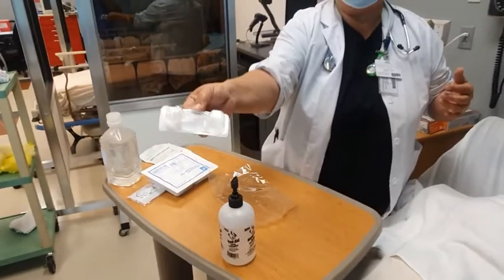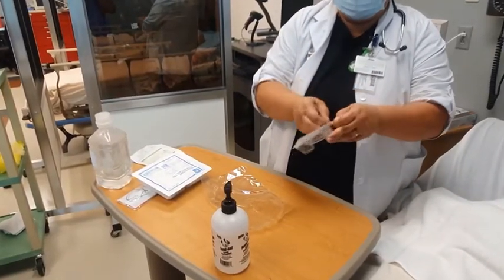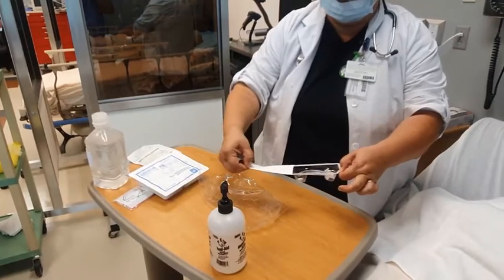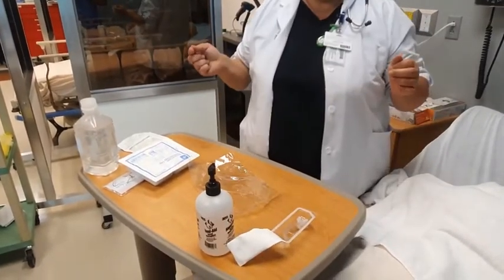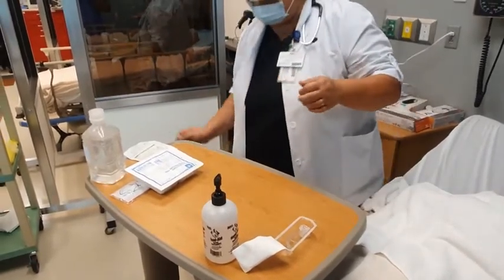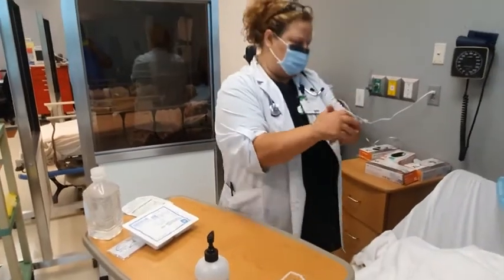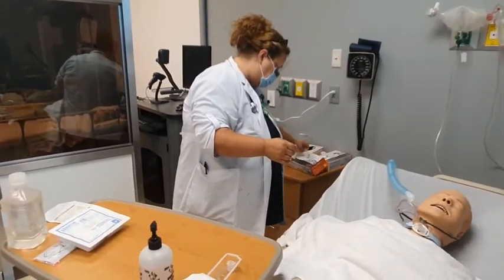So this is the inner cannula package that we're talking about, and you have it open. Put on another pair of non-sterile gloves. Okay, you can clean your hands again, because I know a lot of y'all do. You put on non-sterile gloves.